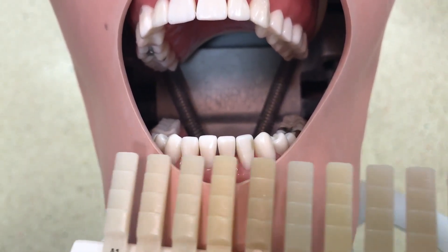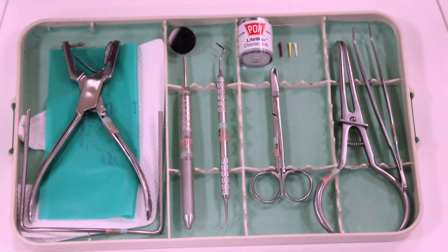Today we'll start by shade selection. We do this step before applying the rubber dam.